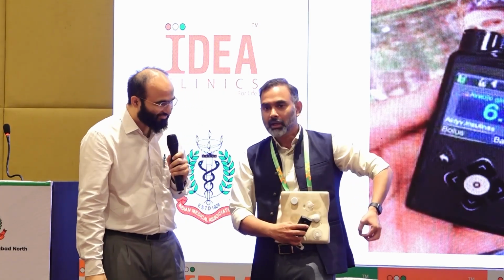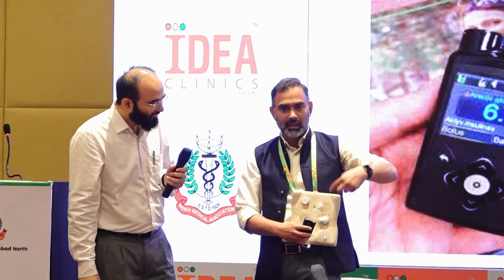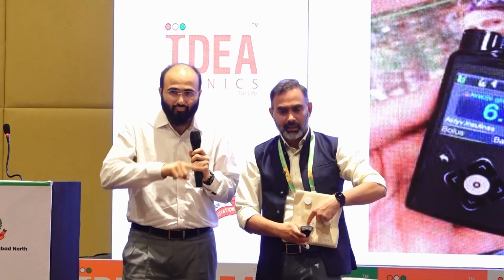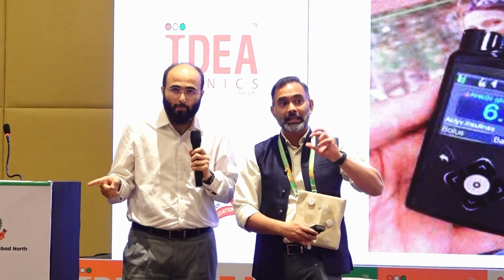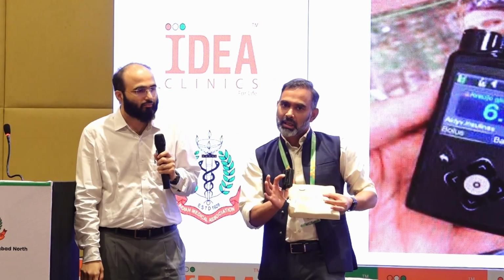So anyway, this transmitter comes out. You can recharge it and go back on it. This transmitter then takes signal from the sensor, sends the signal back to the pump. The pump then decides how much insulin to deliver. Yeah. So all of this is not expensive.